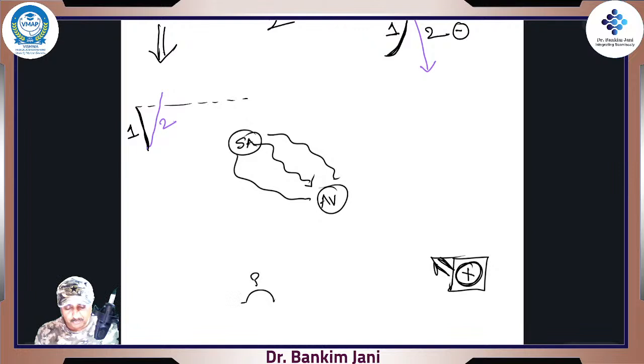Now why did it happen? It happened because current went into this. So if we draw it, it was like a spike, positive. And this is happening in atria. So we call this atrial depolarization, positive. When there is depolarization, it has to fall also, so that comes to atrial repolarization. Fine, but depolarization is crystal clear.